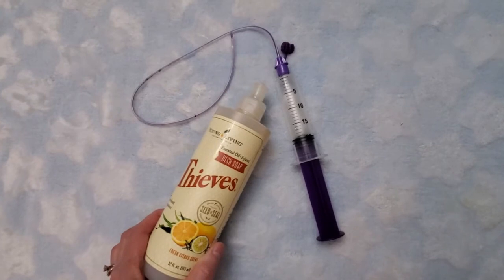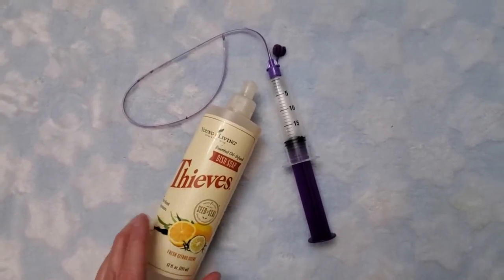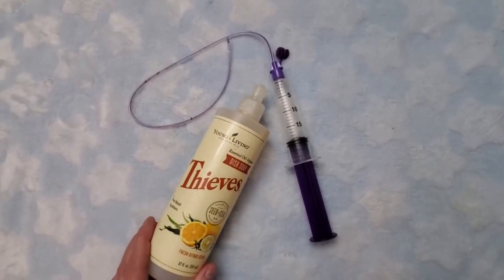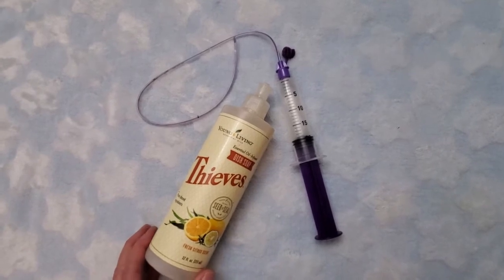I use Thieves dish soap and I just make some soapy water out of this. It's safe, it's natural. It's not going to harm anybody. It doesn't have toxic ingredients in it like things like Dawn or some of the other soaps have in them.